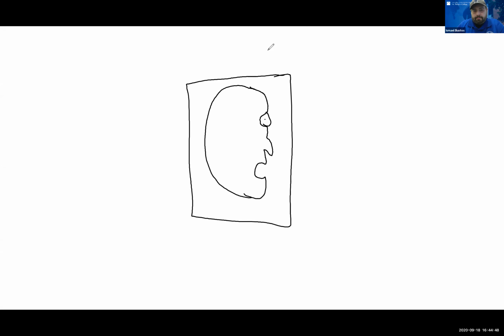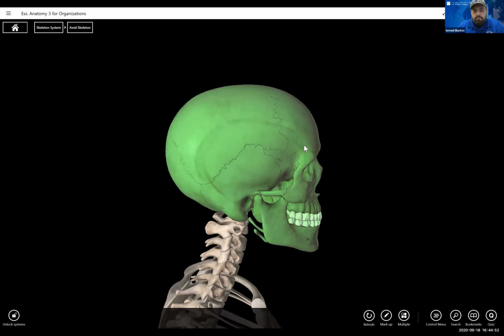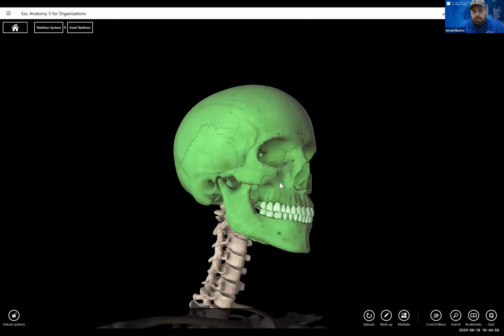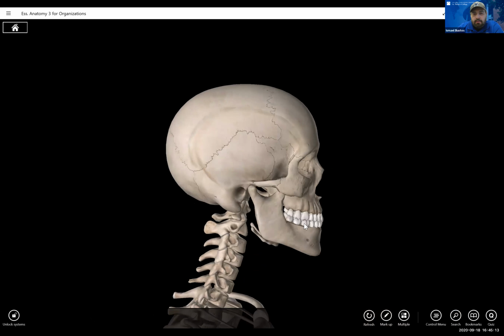So if I'm in a lateral, I want the imaginary line that goes from there to there. I'm looking at that line there. So keep that in mind because it's not going to save it on there. Okay, so that line needs to be perpendicular to the image receptor, which is behind the patient.